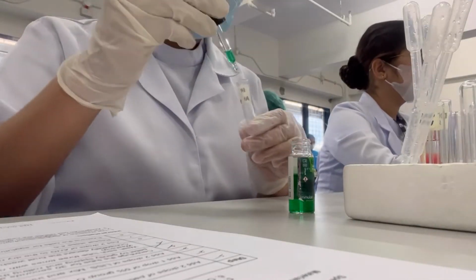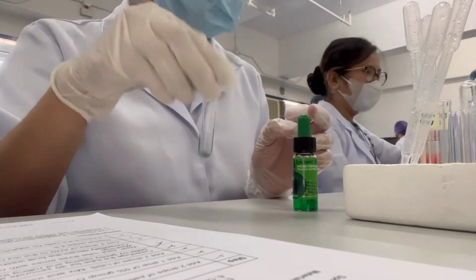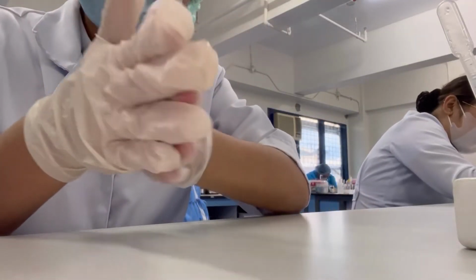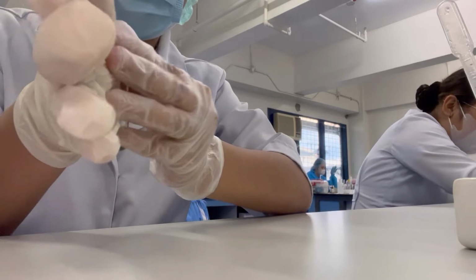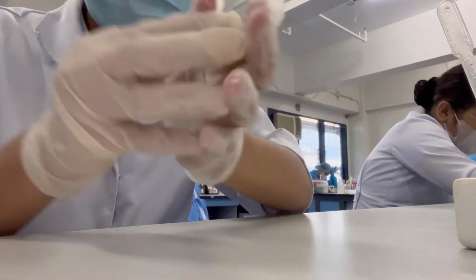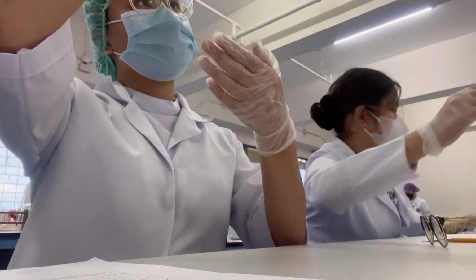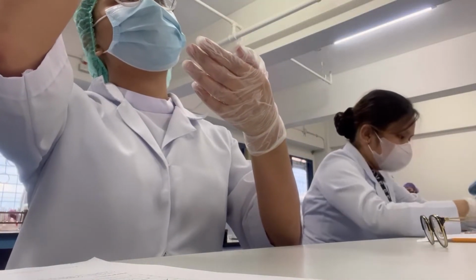Add 2 drops of AHG to the dry red cell bottom and mix well. Repeat steps 4 to 5. Then lastly, examine the cells for agglutination.